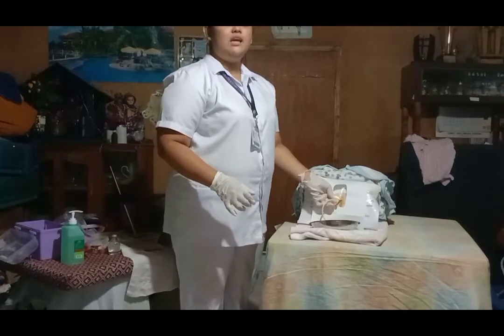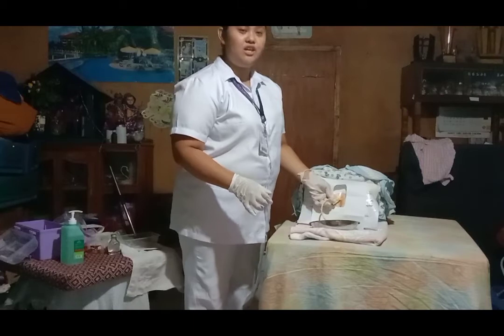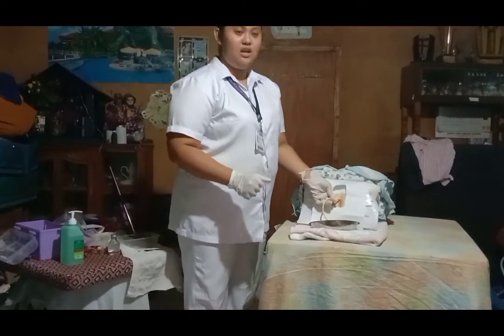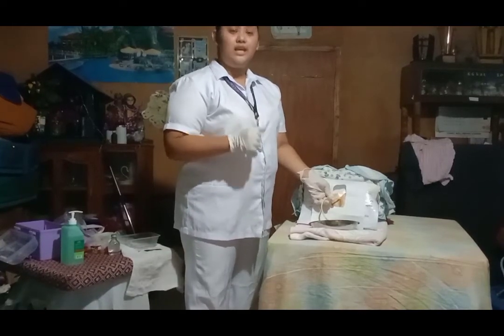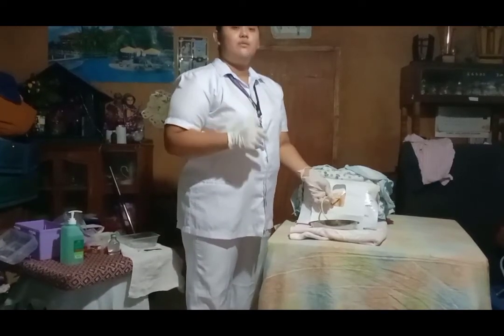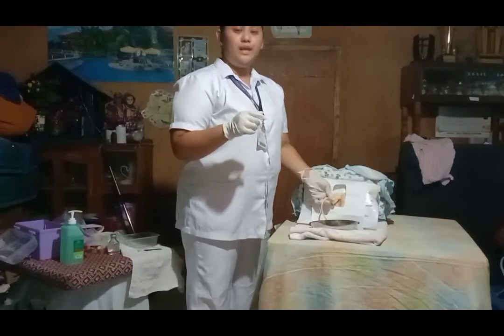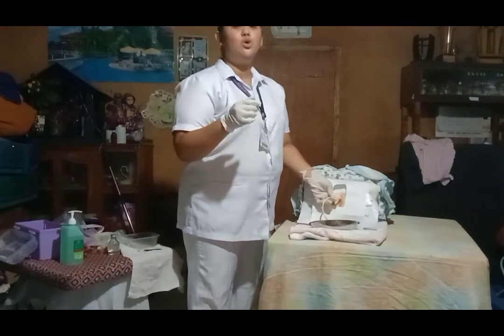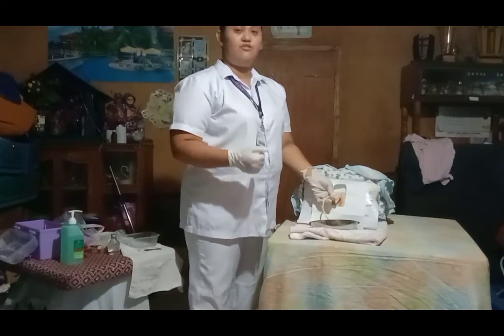And then, if a specimen is collected, pinch the catheter with the thumb and finger while placing the specimen container in position. Urine will flow out of the catheter if the lumen is not occluded. Rest the hand on the pubis while holding the catheter in place to prevent pulling and pushing of the catheter. Withdrawing and pushing the catheter back in the urethra may cause infection of the urethra.